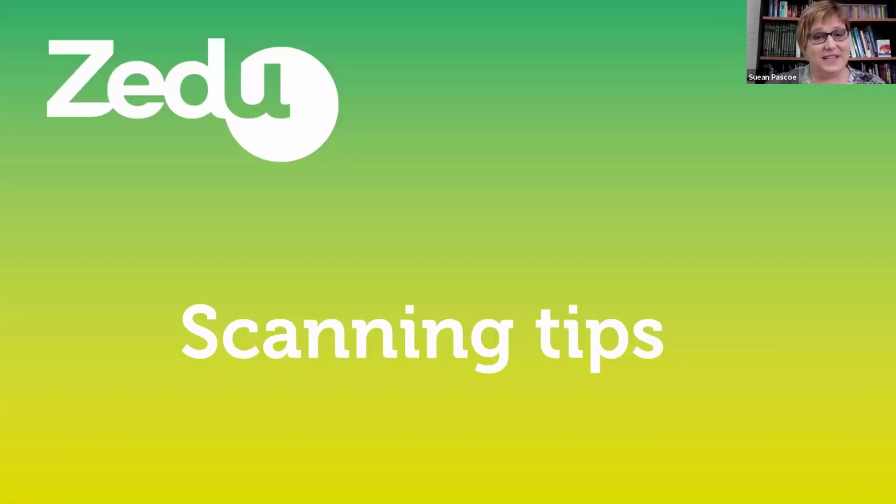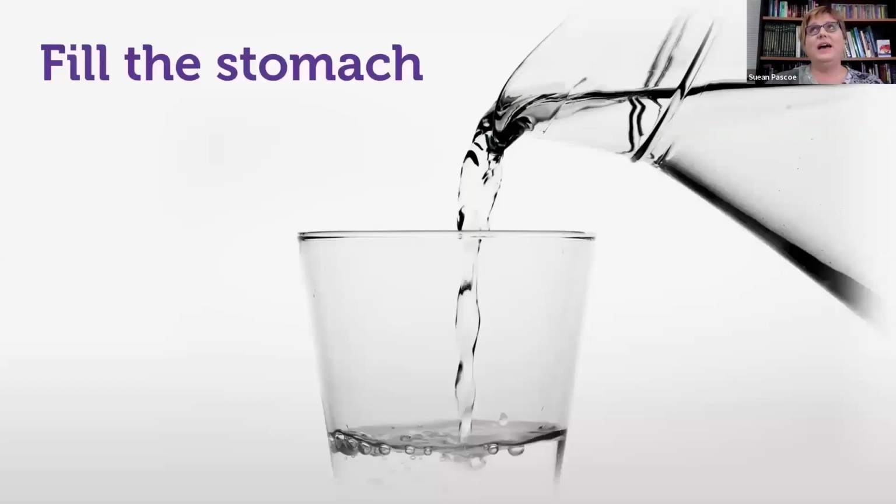Anyway, so some scanning tips here. If you are having difficulty seeing the pancreas, and particularly the tail of the pancreas, you may need to fill the stomach up with water, and I do suggest clear fluids. If you've got orange juice or things with floaties in it, it doesn't work so well. And certainly if your patient has eaten not that long ago, the water is just going to stir up whatever was in their tummy anyway, and so it can make it a little bit messy.